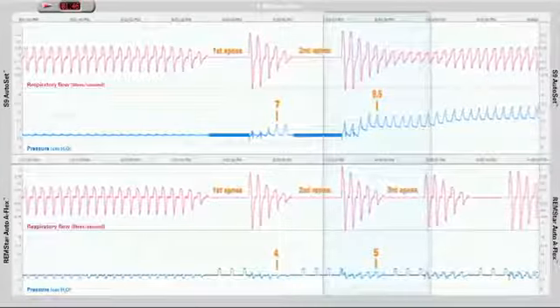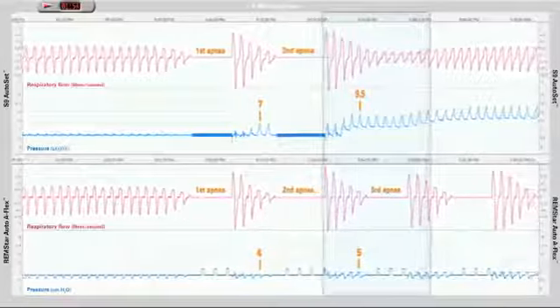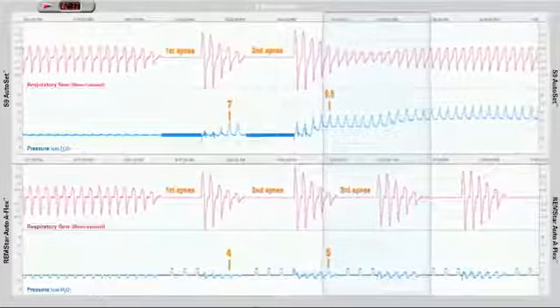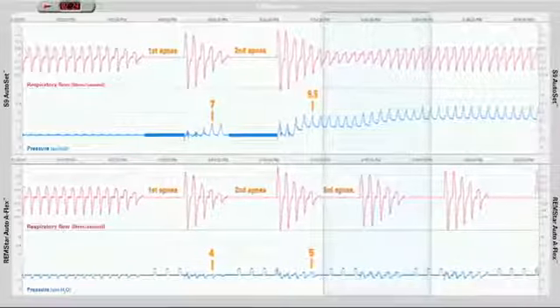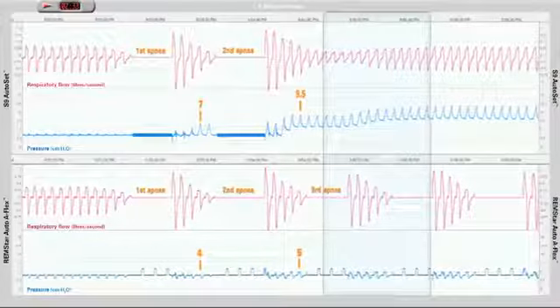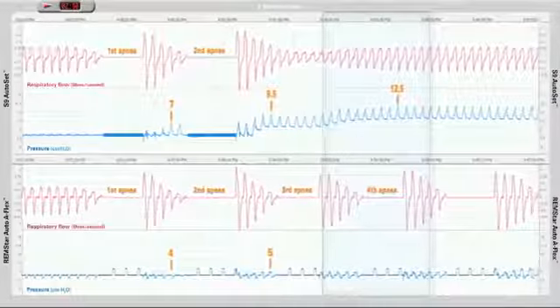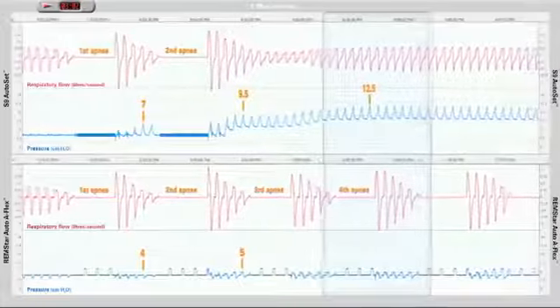The S9 AutoSet detects there is evidence of a slight flow limitation in the breath shape and increases the treatment pressure to prevent further apneas and flow limitation. We now see the S9 patient has achieved normal, rounded breaths, while the REMstar Auto patient suffers a fourth apnea. The S9 AutoSet has achieved a stable airway with a treatment pressure of approximately 12.5 centimeters within 3 minutes.